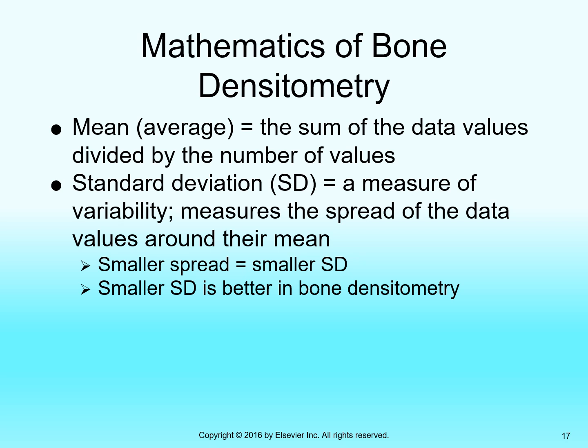Okay, the average itself is aiming for the truth and is a good aim at the truth. The standard deviation is telling you information about the precision of the measurement. That is, how consistent is the machine measuring that specific value, like 15.